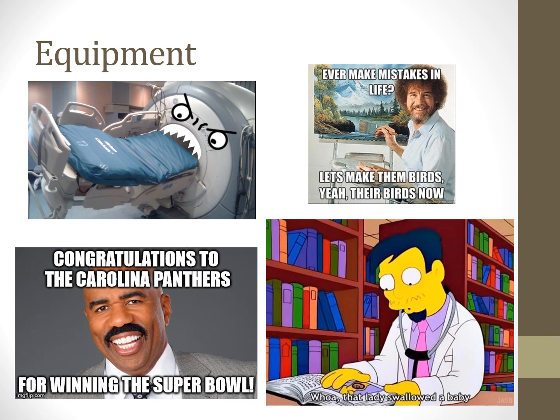Or have someone bring you a different ventilator and change out the machine. But remember, in this situation, always start at the patient and then work your way back to the ventilator. So always start at the ET tube or the tracheostomy tube and work your way back. So always follow it: DOPE, dislodgement, obstruction, pneumothorax, equipment. You will thank me later for this.